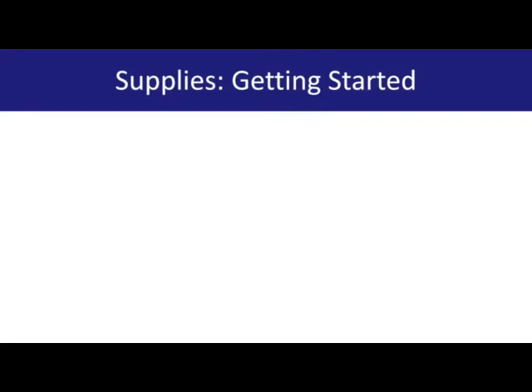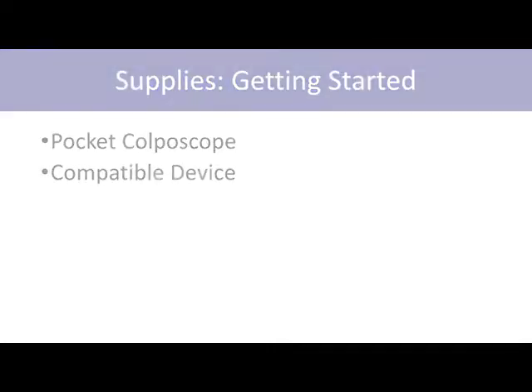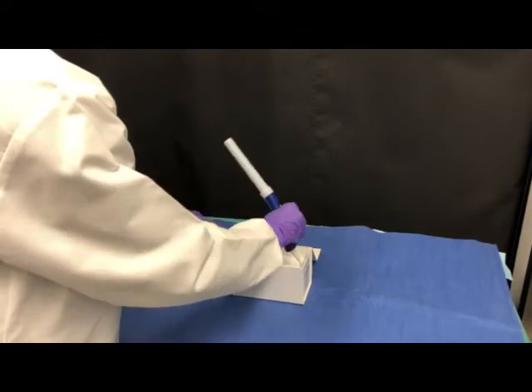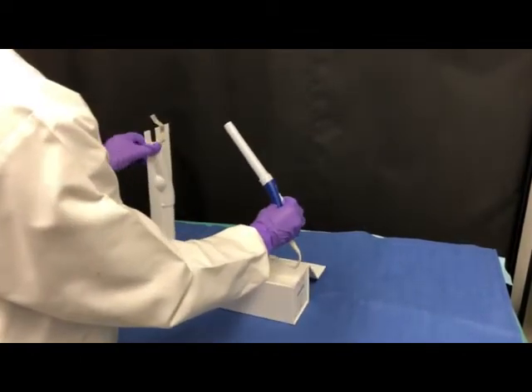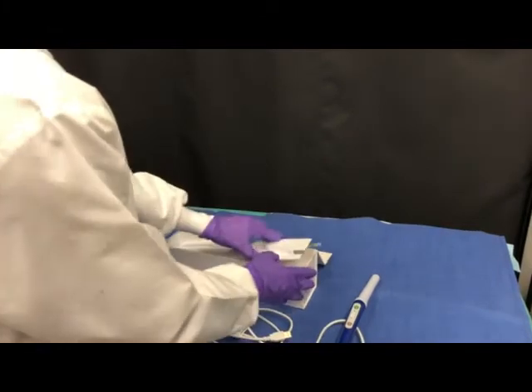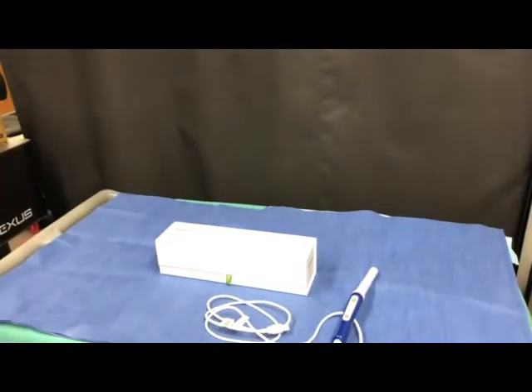To get started, you'll just need the pocket colposcope and a device with a Windows, OS X, or Linux operating system that has the pocket colposcope software. Prior to use with the patient, ensure the device has been properly reprocessed. If cold sterile water was used to rinse the probe, allow it to return to room temperature before proceeding. Examine it for signs of damage, wear, or abrasion. Verify that no parts are missing or loose. If the pocket colposcope appears damaged or malfunctioning, discontinue use and contact Hadley Health Technologies.